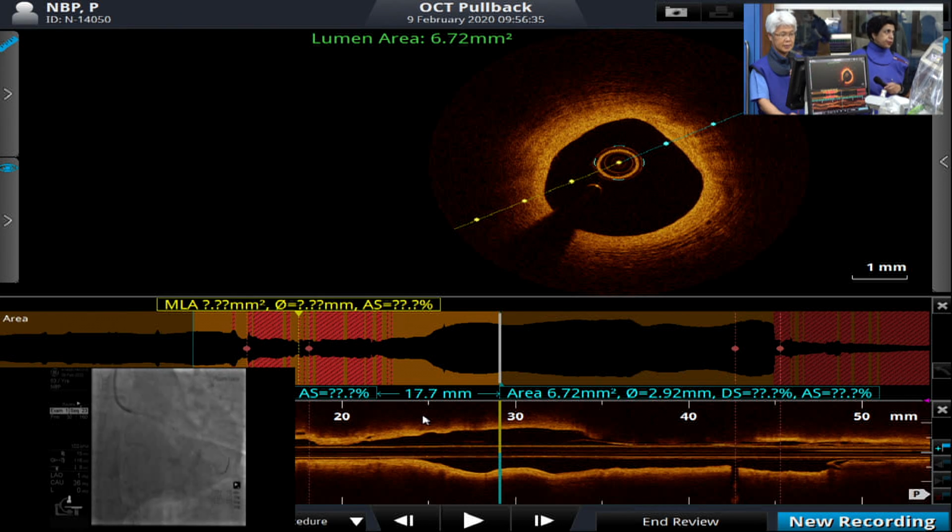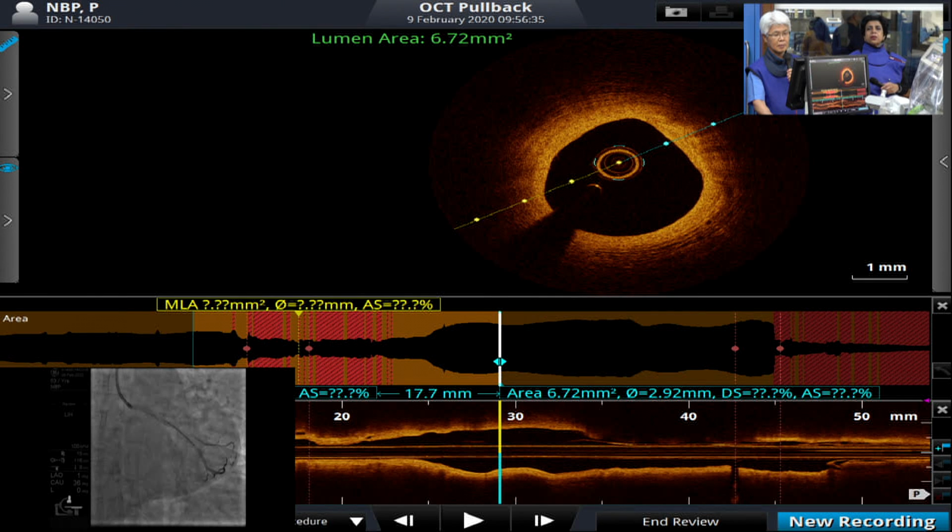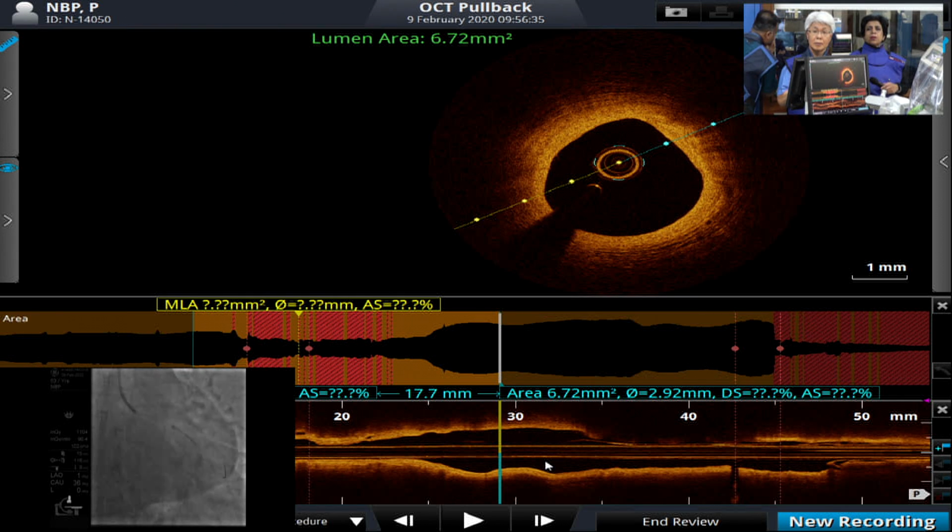Yes. So actually the comment that one of the persons here made, I don't think we addressed it properly. His question was, and I'm a little bit concerned about this too: when you put a smaller stent and then post-dilate it with the same stent balloon at higher pressure, the size can increase by 0.2 or 0.3 or even 0.4, depending on the stent you're using.